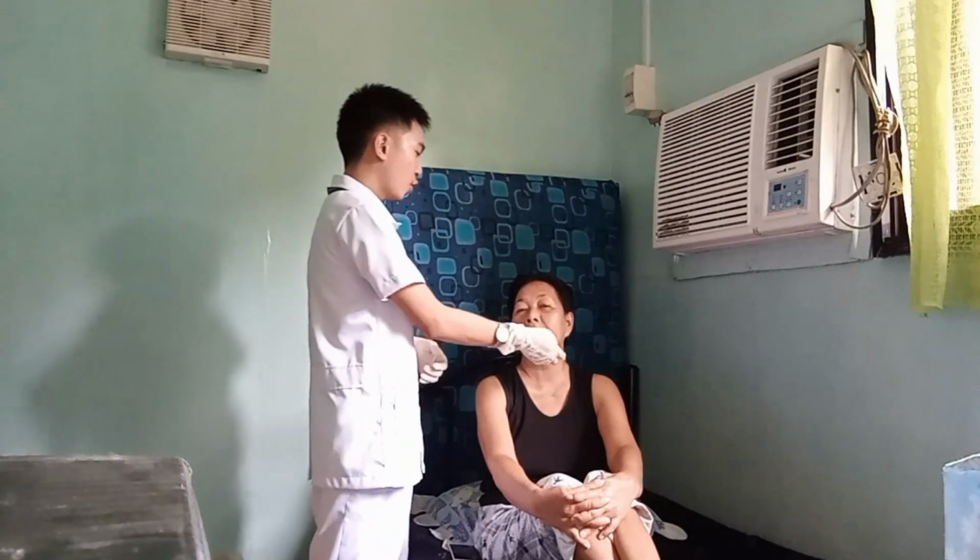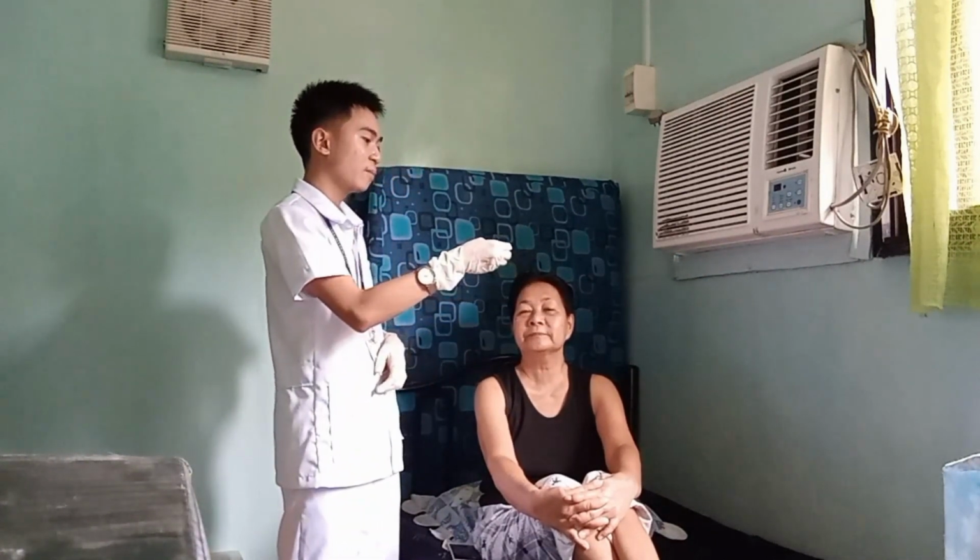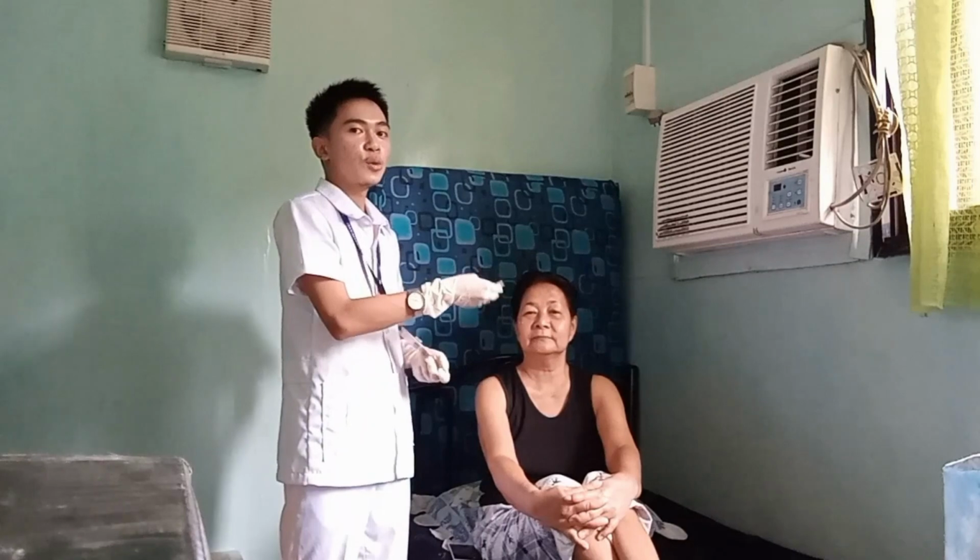So, can you open your mouth? So, your temperature is 35.2 degrees Celsius. So, remove the thermometer and wipe the tip of the thermometer using an alcohol swab in a firm twisting motion, from stem to probe, to lessen the spread of contamination. So, wipe from least contaminated to the most contaminated area. And wash the thermometer if necessary and return it to the storage location.